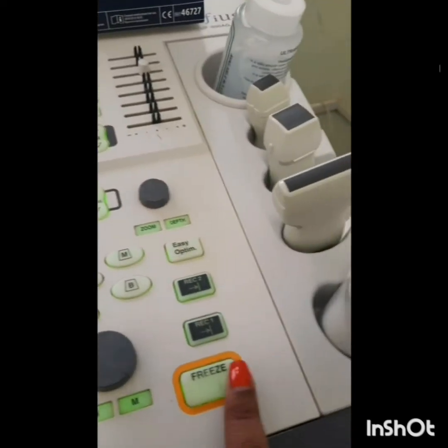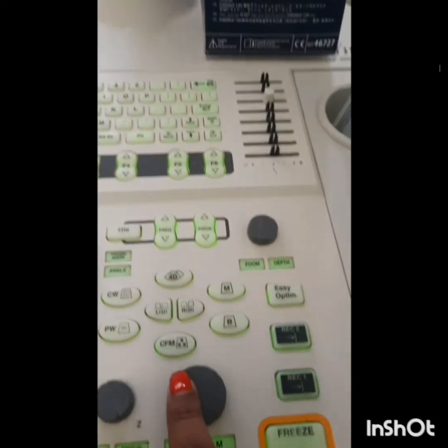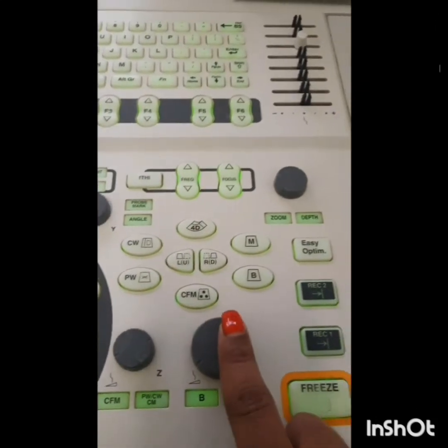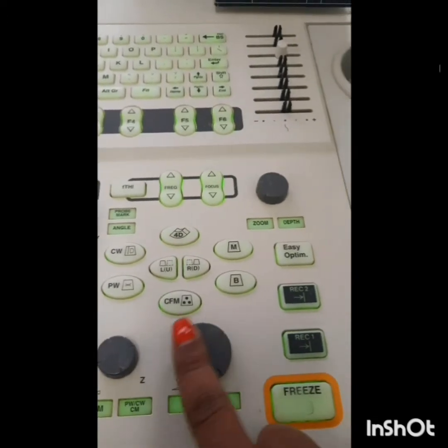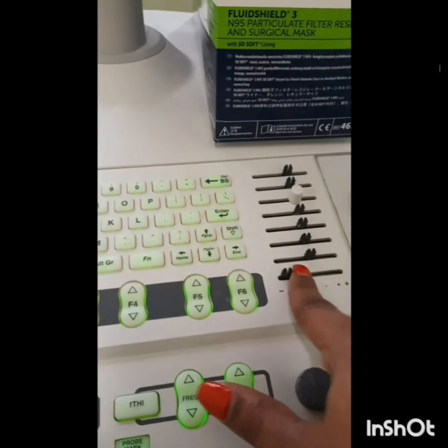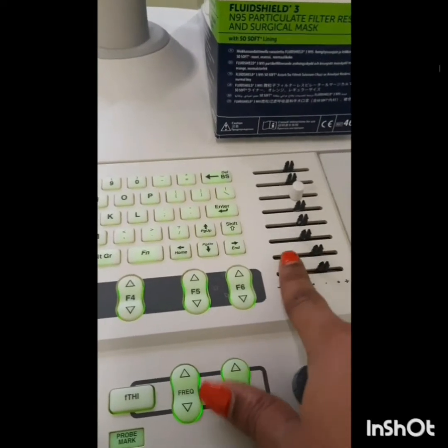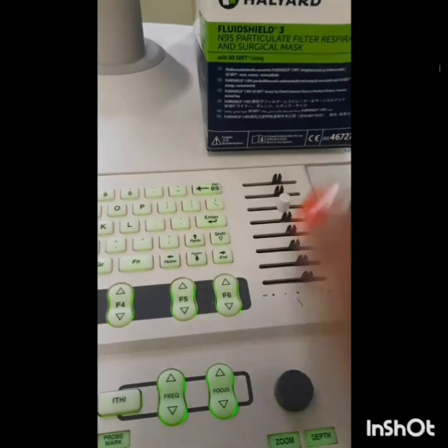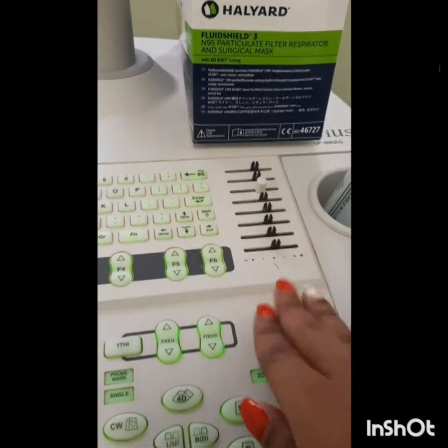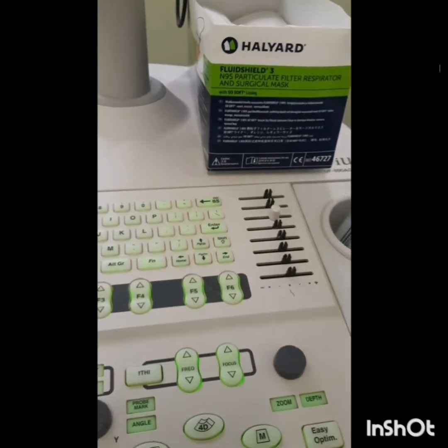And then this is your freeze button. This is the overall gain. With overall gain, the entire image intensity is either increased or reduced, unlike the TGC, where you can choose at what level along the beam axis you want your image to be darker or lighter.